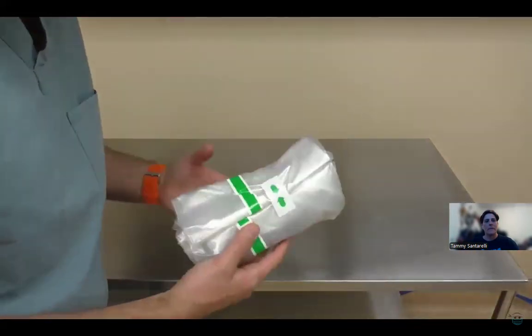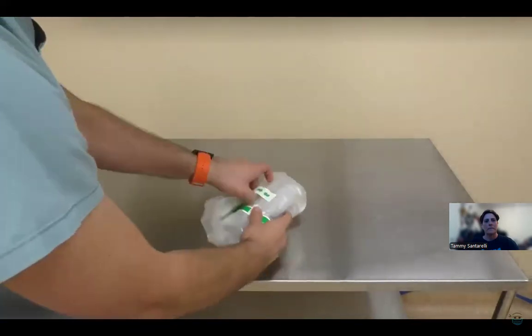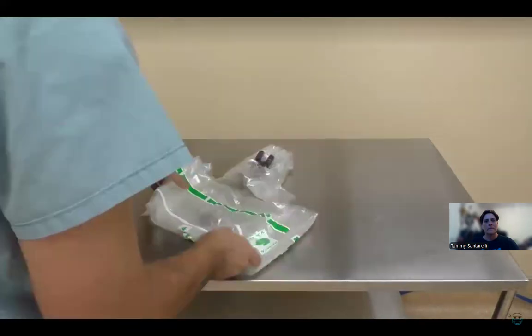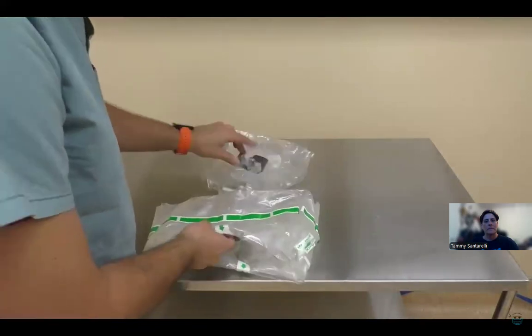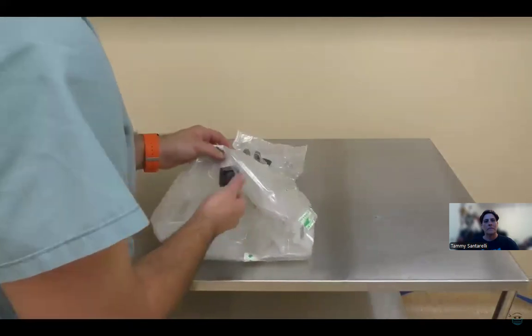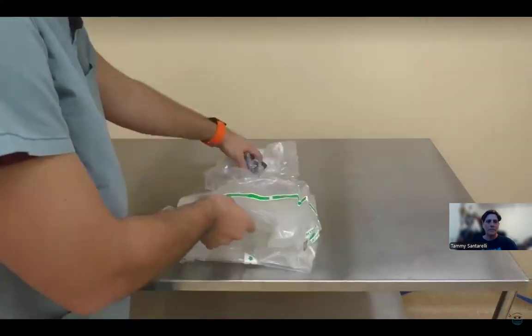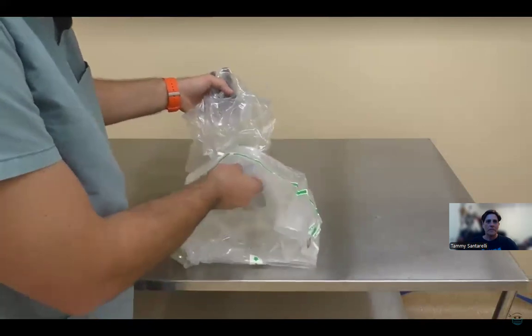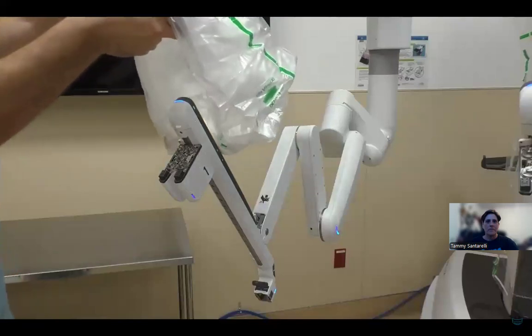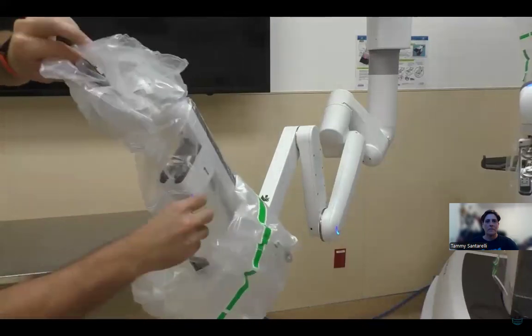This is the arm drape as you're going to get it right out of the package on your field. So it's on your sterile field. Pop this tape open and fold it out. You want to make sure this piece and this piece are facing forward when you drape this. So I like to put, obviously this is my hand, but sterile hand, and I like to grab both of these plastic pieces together and go directly over the arm like this. Starting it on the outside and kind of dropping it and draping it over the arm itself.